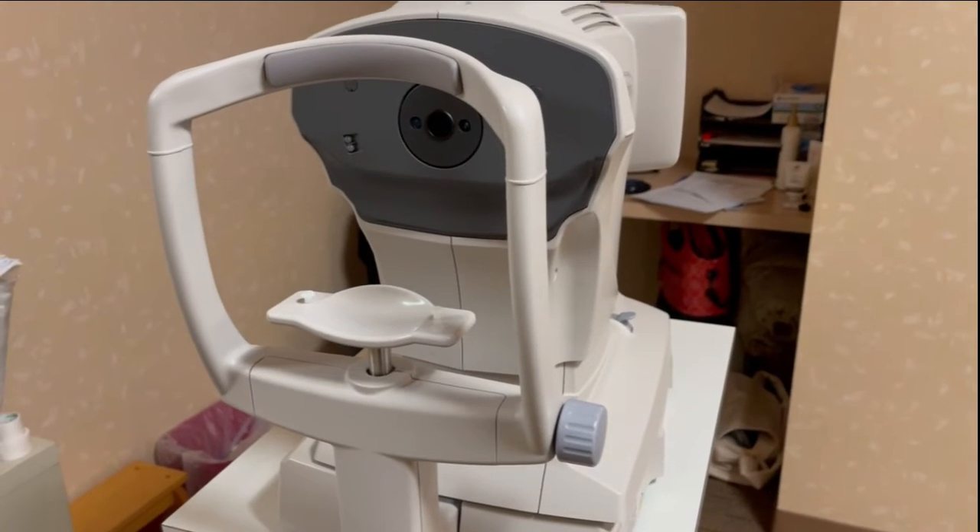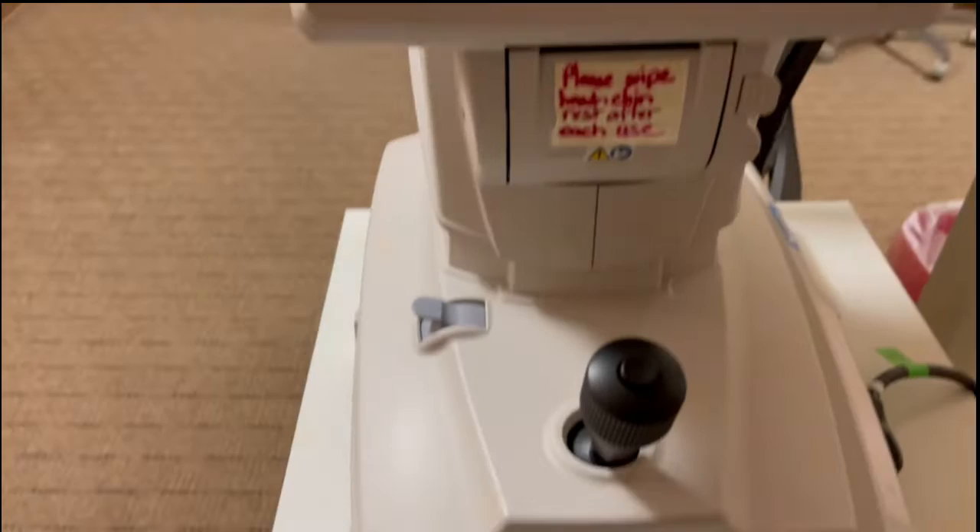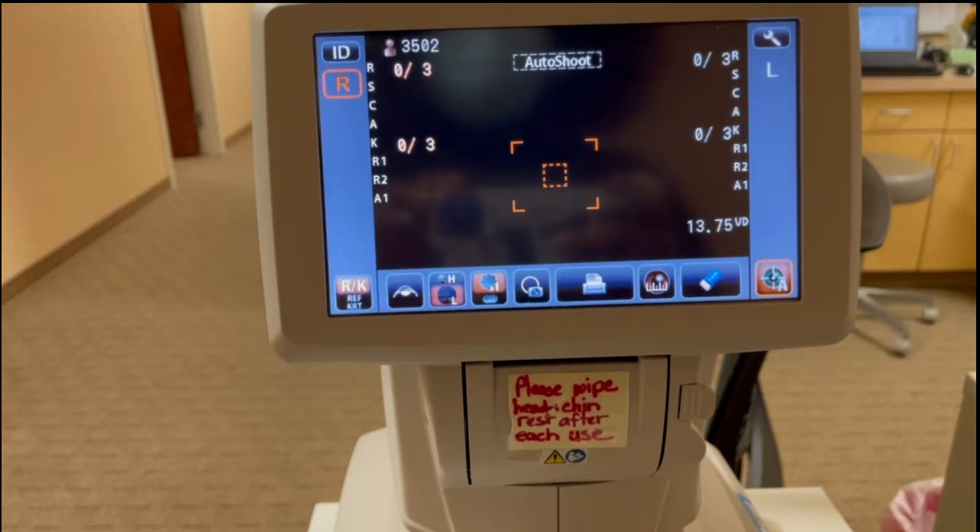This machine here is our autorefractor. It's basically a machine that we use during the examination — it gives the doctor an objective measurement of your refractive error, or basically in shorter terms, the prescription in your glasses. This here is the back of the machine — that's where you put your chin and eye. Normally you see a farmhouse or a hot air balloon, something like that, depending on what type of machine it is. We don't do this for every patient, only for some.